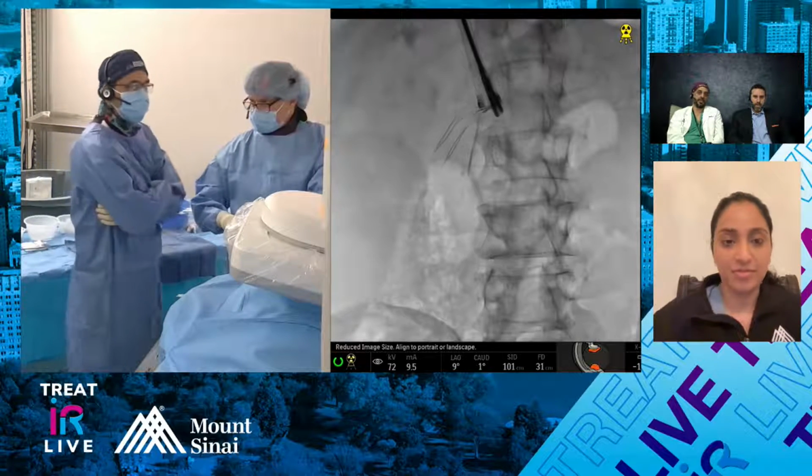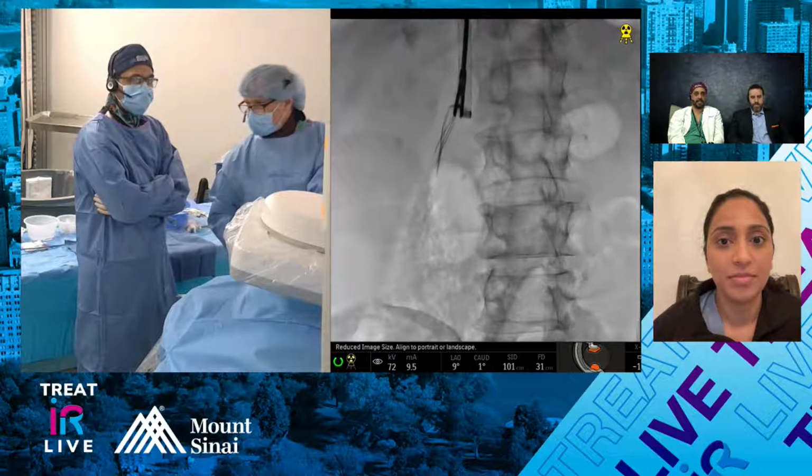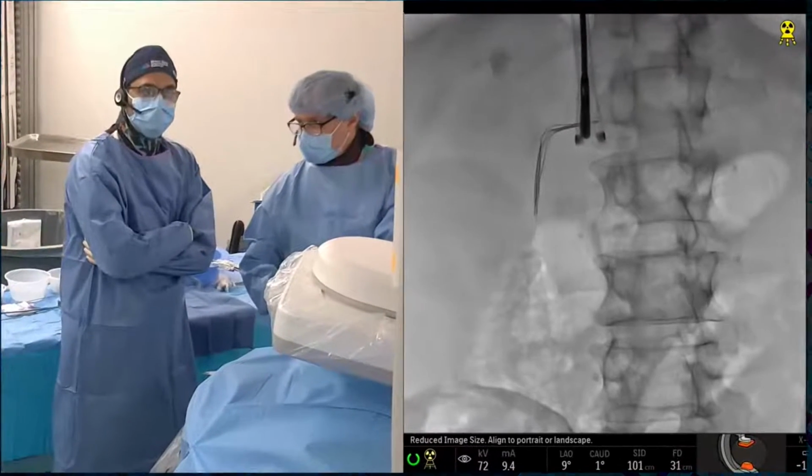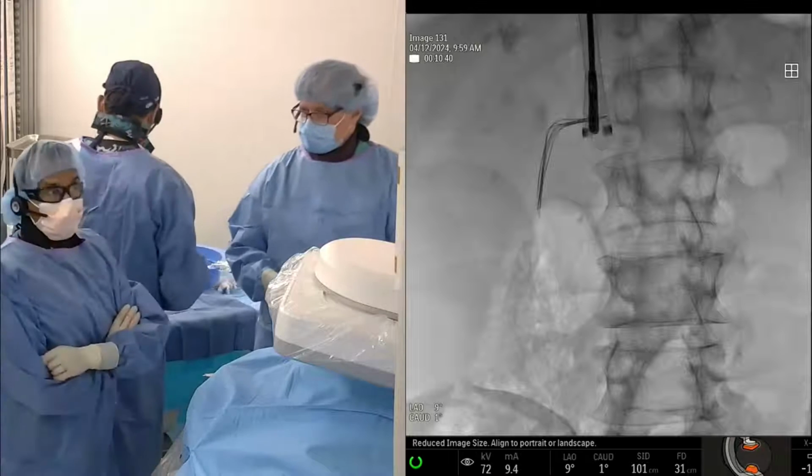Maybe we can. I don't think we have a second forceps. Right now it's sort of pinned, right? You could use the other sheath to pin it. Although now, are you guys going to try to go from the groin? What's the thought process now?